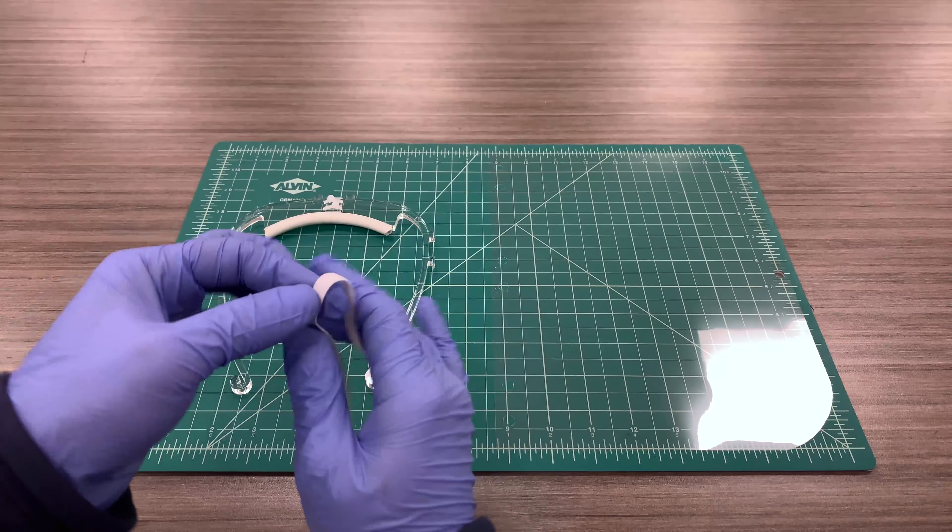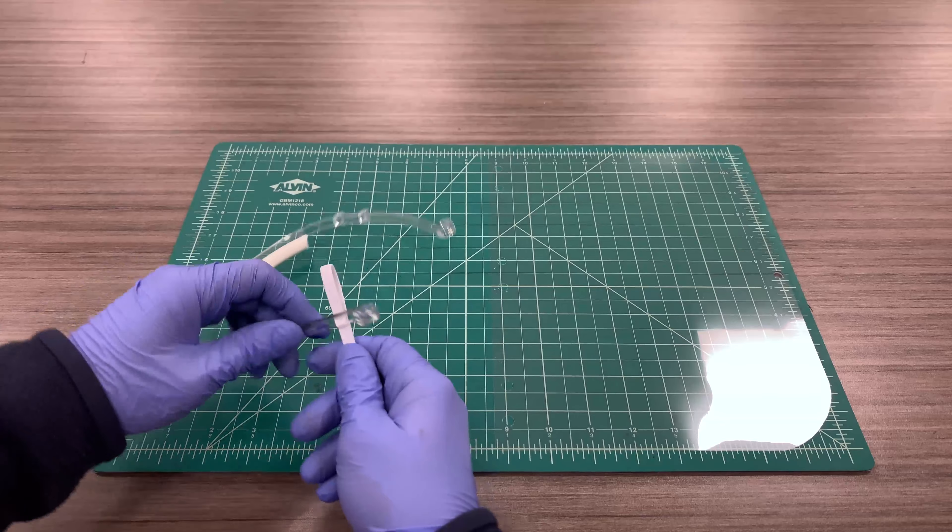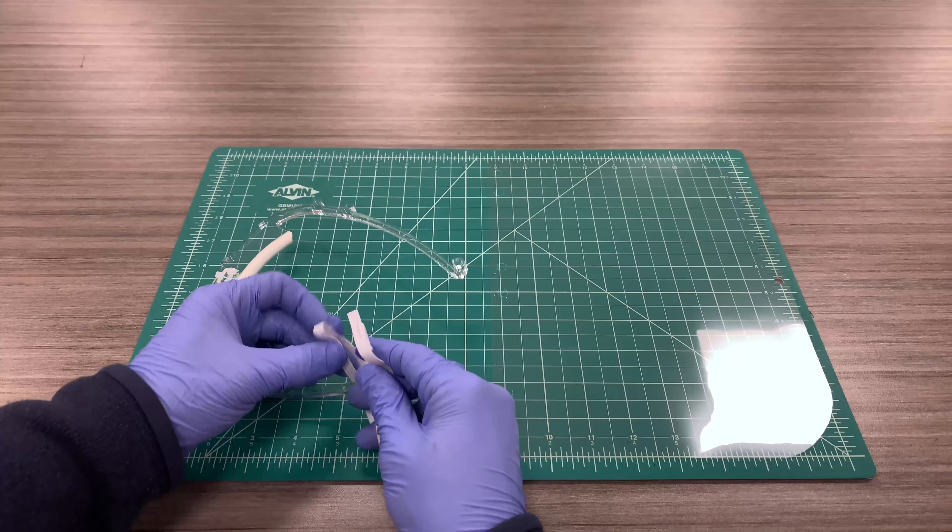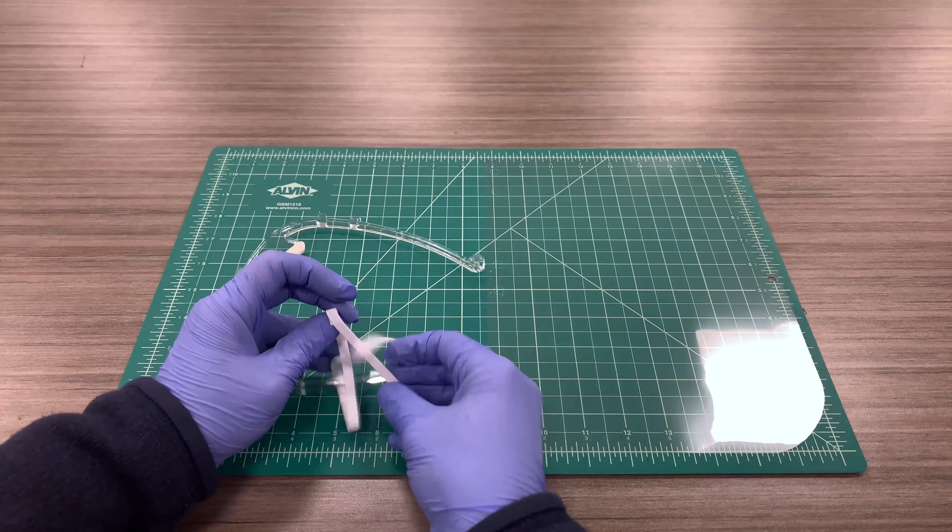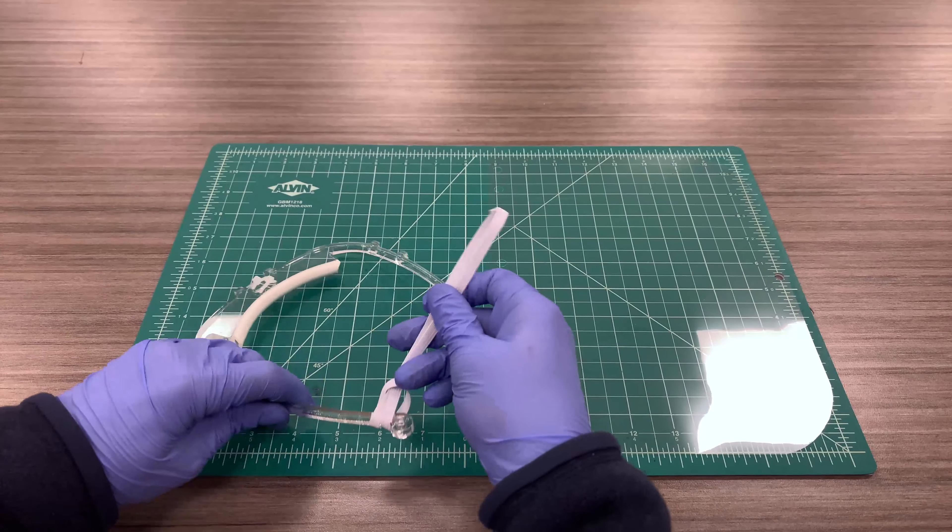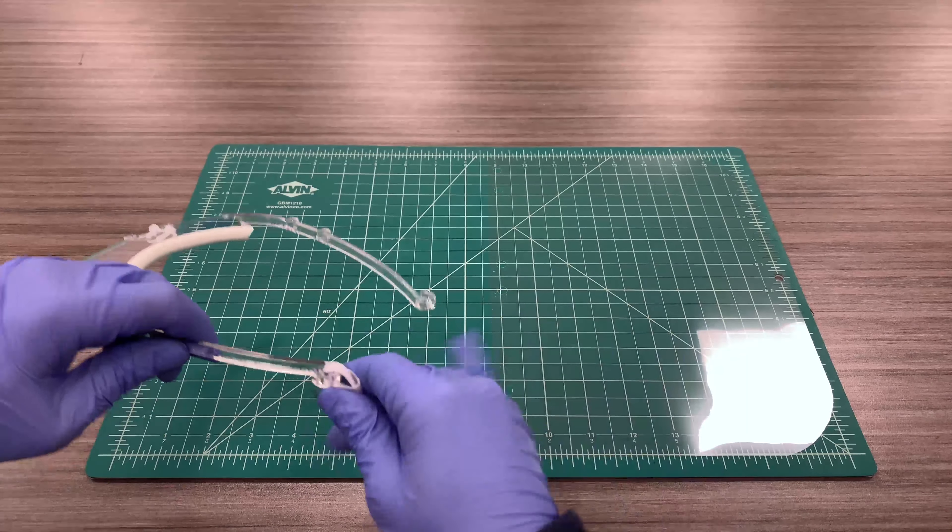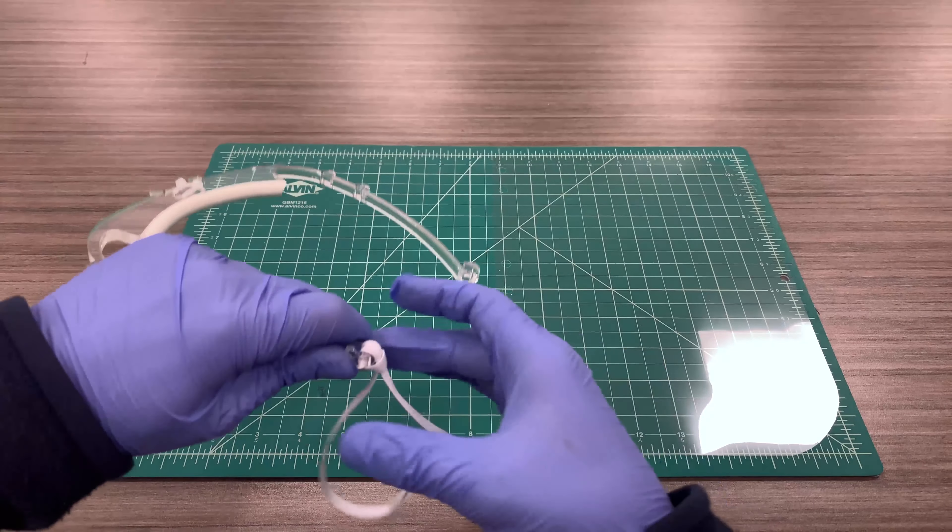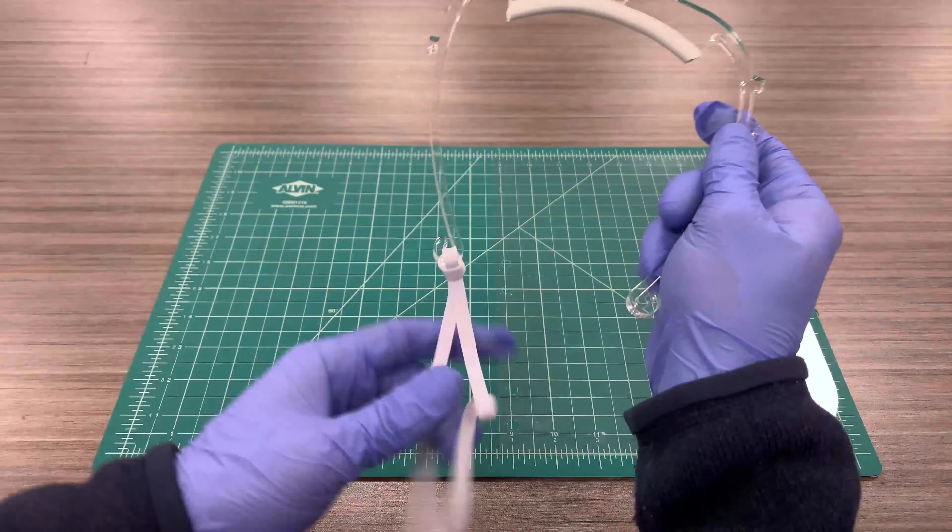All right, so now we want to attach the elastic loop. You're gonna take one end, push it through the other, and pull it all the way to the end and cinch it as tight as you can. Just like that.